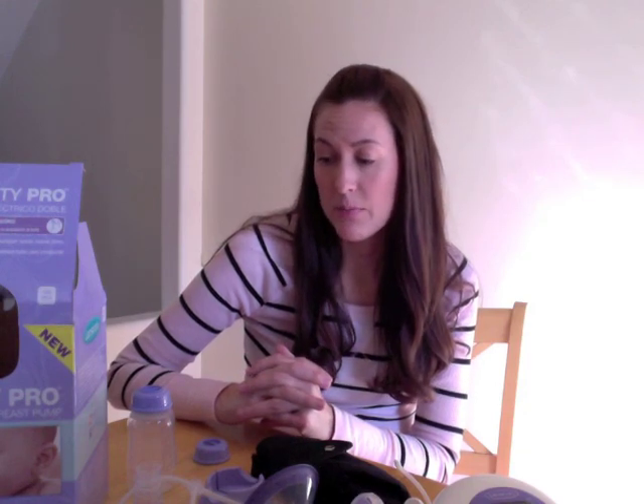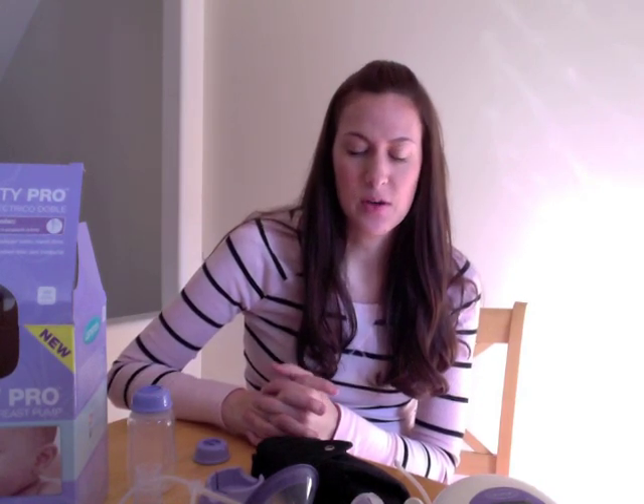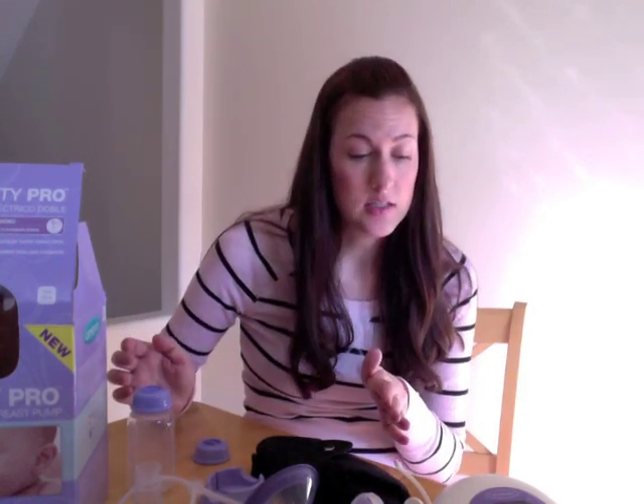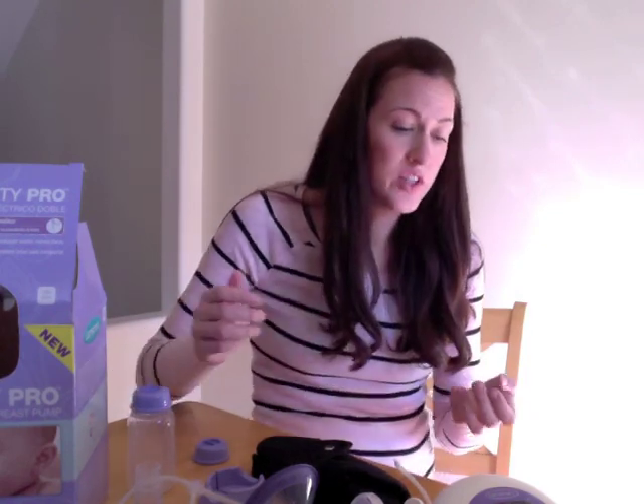I didn't use a Lansinoh breast pump with my other two — I did use another brand — but I'm really excited about this one because I think breast pumps have come a long way since I bought my first one, like seven and a half years ago. I'm not going to give a full review, obviously, because I'm not going to be using the pump until the baby's born, but I wanted to give you an overview and show you what the pump comes with and some of the cool features about it.